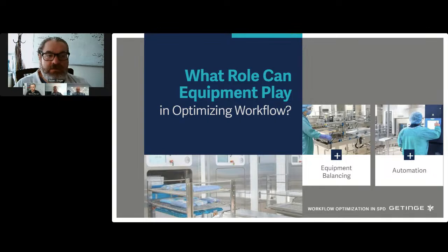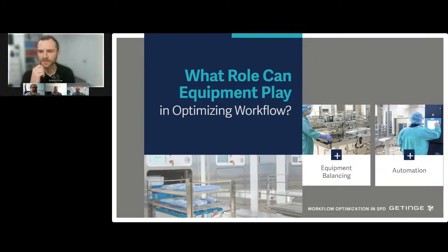To the point that when I first came into the facility here, we took shelves out of some of our sterilizer racks, with the intent to get the staff to push the trays into the sterilizers without waiting. And it made a huge difference on overall turnaround time. Wow. So less is more, taking racks out of your equipment moved things through faster. Bobby, I've experienced, yeah, go ahead.